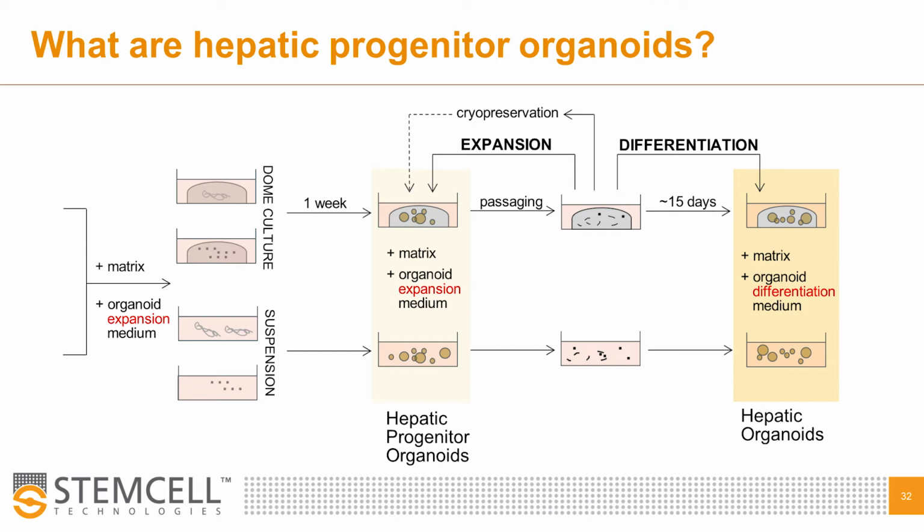For those of you who are familiar with the mouse intestinal organoid system, you will notice an expansion and differentiation step is required to obtain differentiated cell types in hepatic organoids, while mouse intestinal organoids are obtained with a single culture medium. This is reflective of the intestinal versus hepatic physiology, since the intestinal lining in the body is composed of both differentiated and highly proliferative cells at homeostasis. The signals for proliferation in the liver, however, are typically quiescent in regions of mature hepatocyte function.